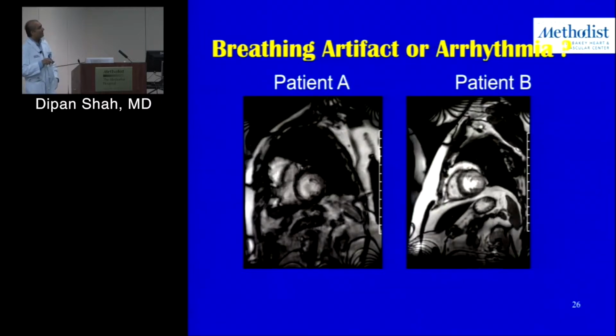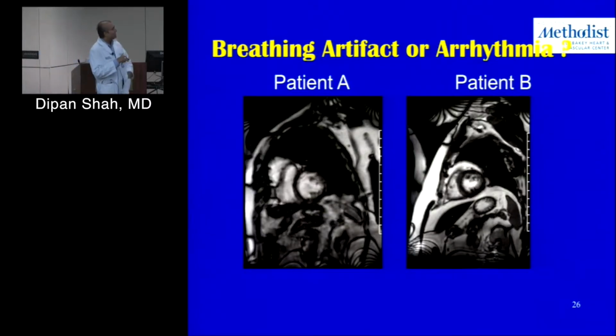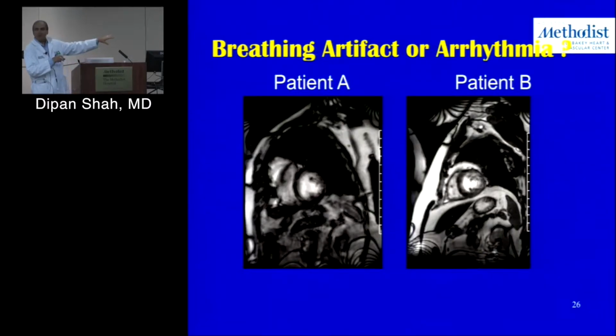But remember, it's not so much that the organs are moving, because the organs could be moving on this here as well. Look at the abdominal structures. Are they nice and sharply demarcated? Remember, the breathing isn't synchronized with the cardiac cycle, so you're not going to see breathing motion that synchronizes with your cardiac cycle. What you're going to see is the image looks blurry.